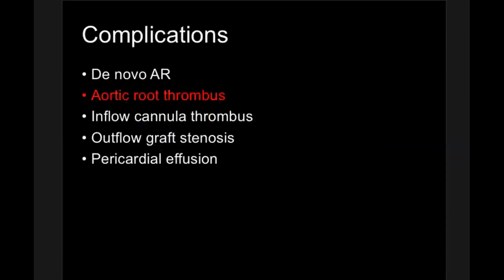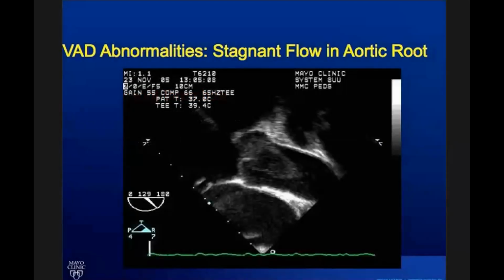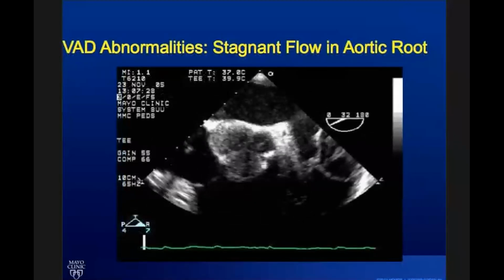Aortic root thrombus is important because of the lack of aortic valve opening, with native aortic valves, or in patients who have aortic stenosis or mechanical or prosthetic valves. And this is just a 2D image that I borrowed from the Mayo slides, looking at the stagnant flow in the aortic root, and then in the short axis showing the thrombus and stagnation.